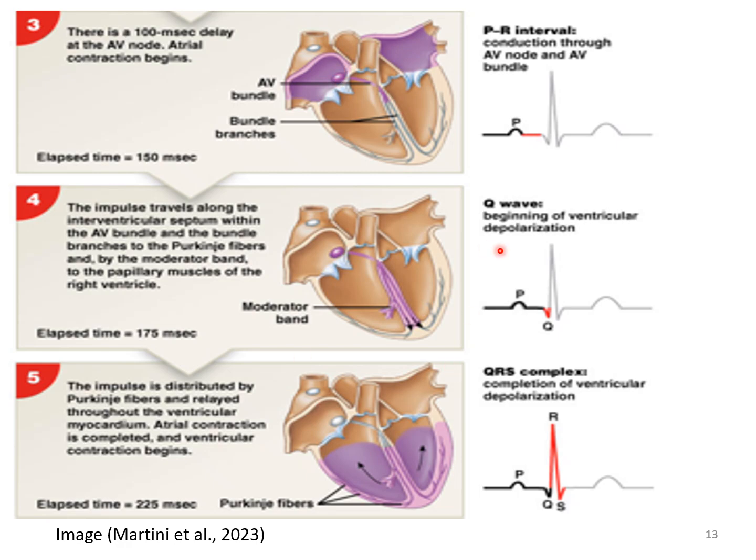Okay, and right here a Q wave is developing. Q wave is going downwards, and then R and then S right here. So right here, as you can see, it is going towards the left and right bundle branch, and then it is the beginning of the ventricular depolarization. Okay, and whenever you see the complete QRS, you're gonna see a completion. The Q wave is the beginning of the ventricular depolarization, going below, and the RS is going to be the completion of the ventricular depolarization.